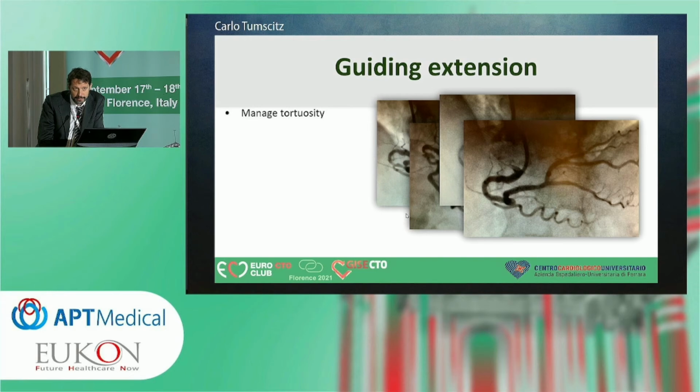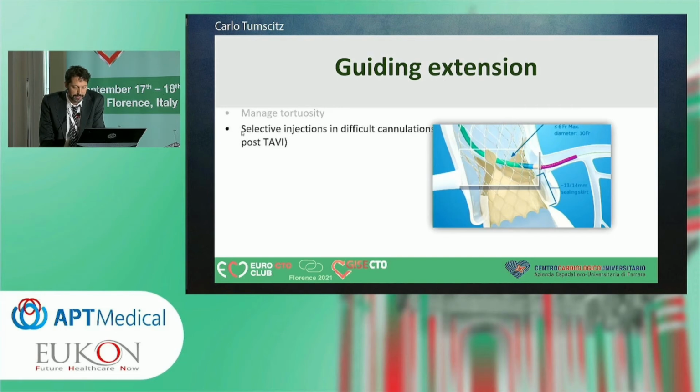My technique that I will share with you is that I use the guiding extension in these cases using a balloon, so an anchoring balloon in the distal part, and then I pull the balloon, the shaft balloon, while I'm pushing the shaft of the guiding extension just to arrive very distally.